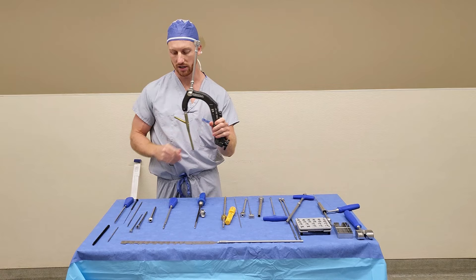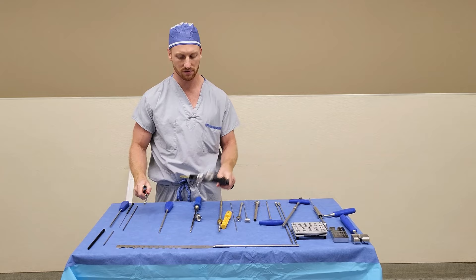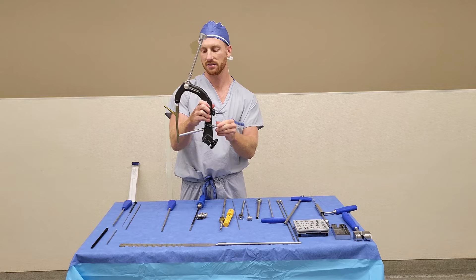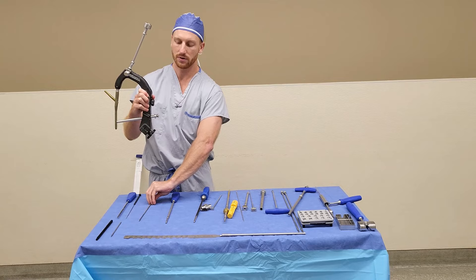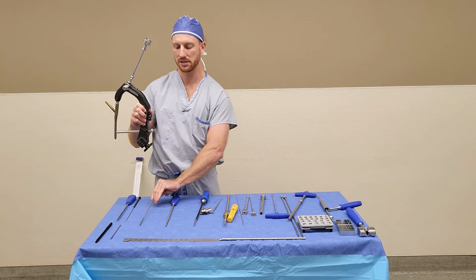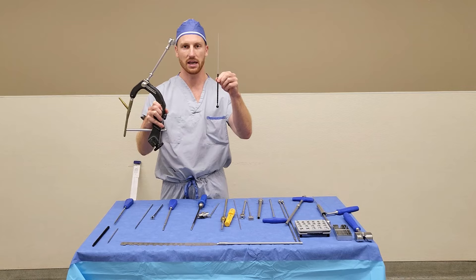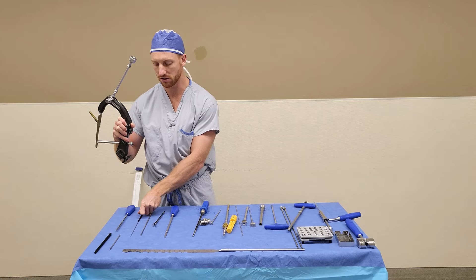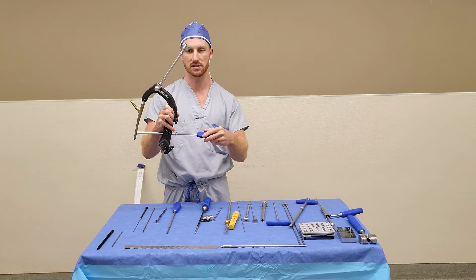For distal locking, you will assemble the three 4.2 drill sleeves. Slide that into the aiming arm on the hole that says static. Remove the trocar and insert the drill bit. When drilling through the jig, you will use the long 4.2 drill bit. Once you've drilled both cortices, the drill bit comes out, the drill sleeve comes out, and you use the depth gauge with just the inner portion to measure for your screw. It simply hooks on the other side of the cortex and you read off the sleeve. To insert the screw, you use your blue T25 handle to insert through the sleeve assembly.